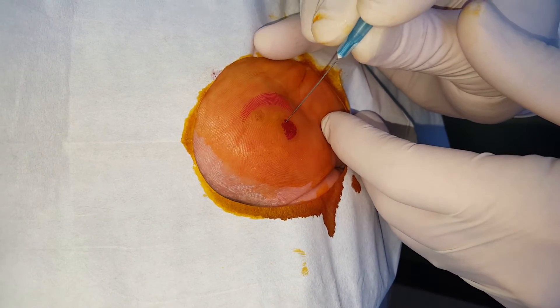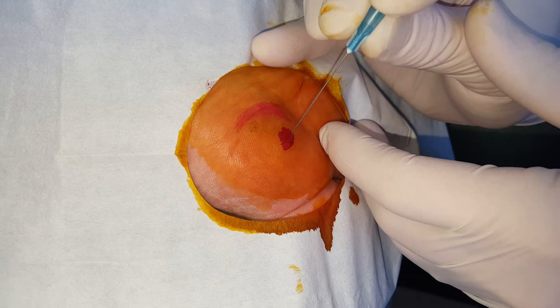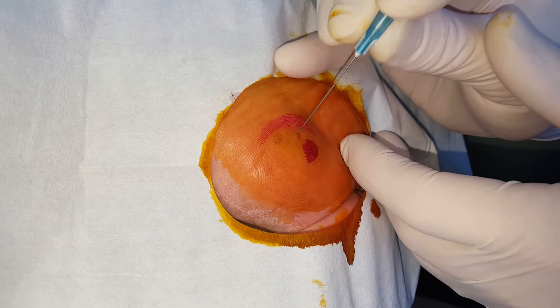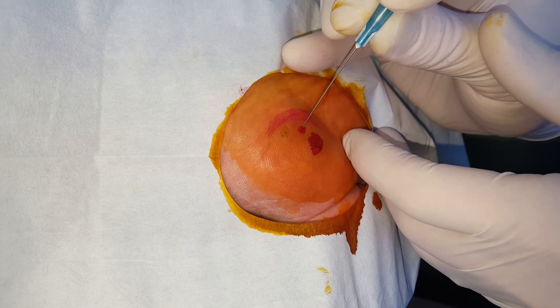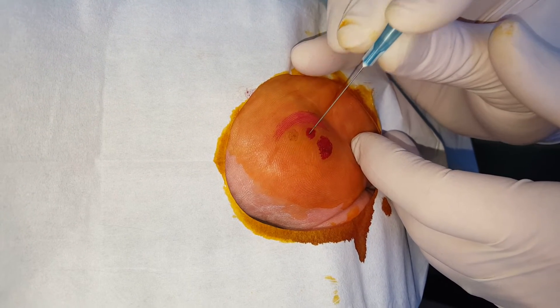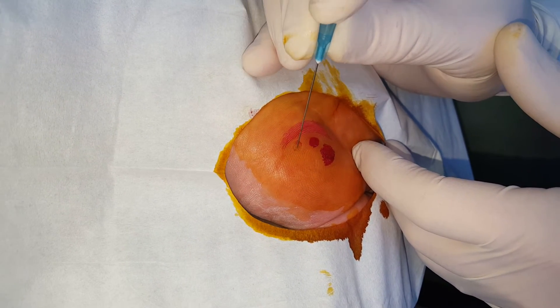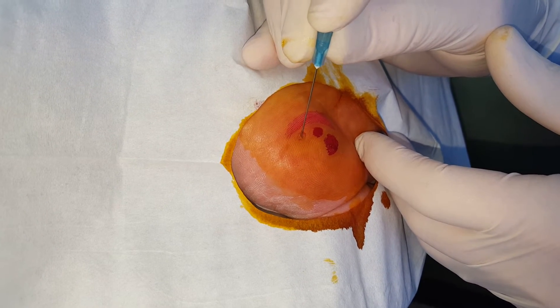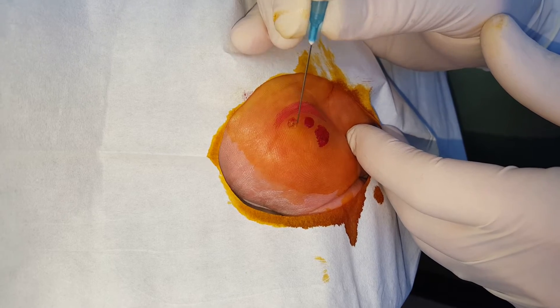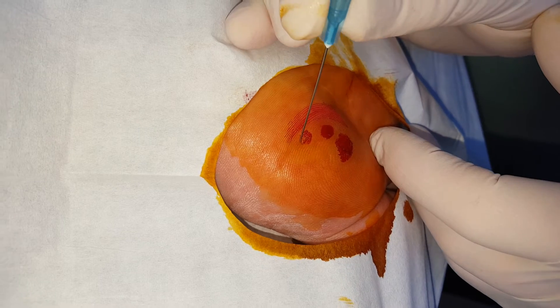I'll just keep going until I feel very low resistance in the remaining areas. I've got three here; we'll just make each of them. You're basically looking to get them about the consistency of a beefy red hamburger. You want bleeding — bleeding is what tells us we've driven the virus underneath the dermis into the sub-Q fat. That's how we get the body to recognize the virus and get rid of the infection.